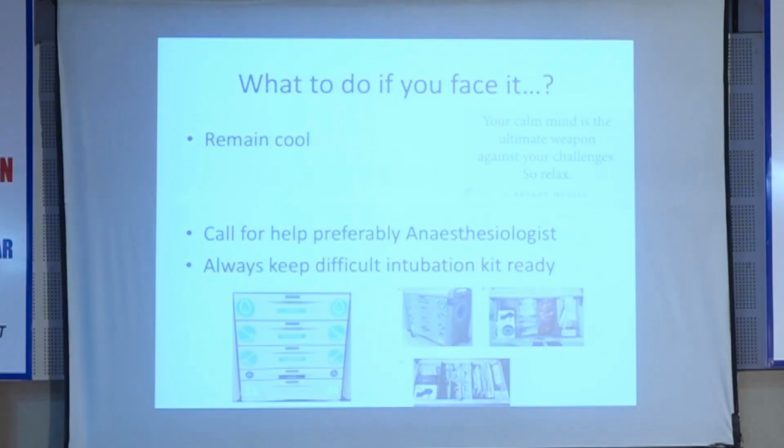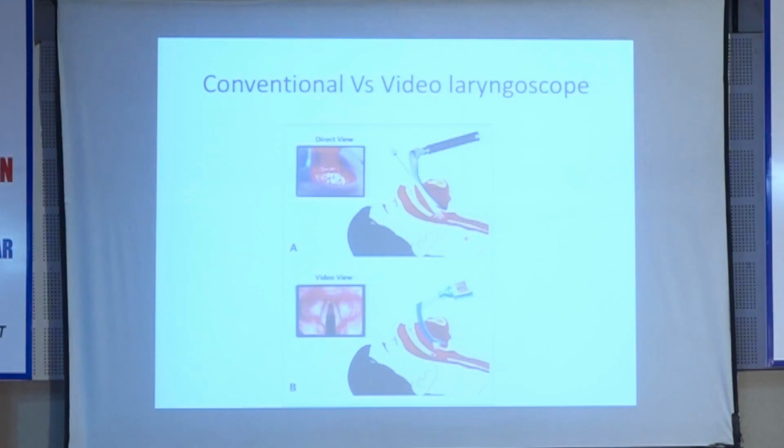Simple things like: can you control his airway? Is the simple Ambu bag ready? Are all sizes of masks ready? Are the laryngeal masks ready? Is the proper set of tubes, including one or two sizes smaller, ready? They are very, very important. Nowadays, video laryngoscopes are coming in a big way.